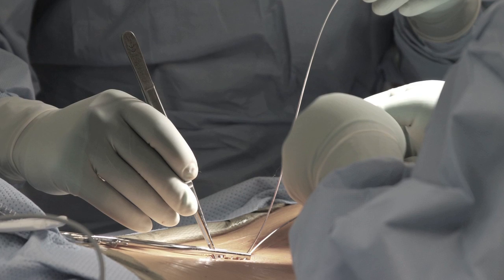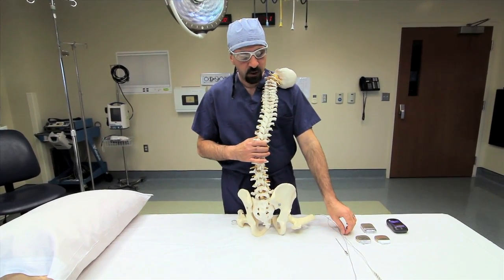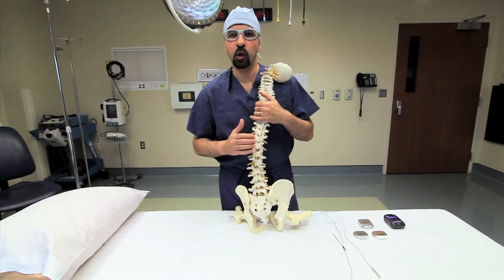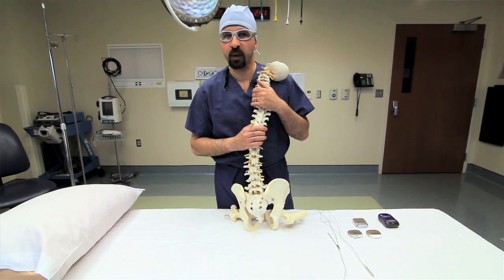We have to do 2 incisions, one midline incision, and the incision made for the percutaneous lead is just to tuck the lead and tie it to the deep fascia. No bone is cut, nothing is done through the actual structure of the spine.